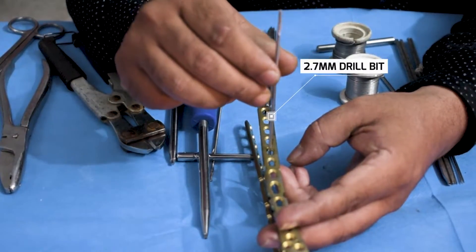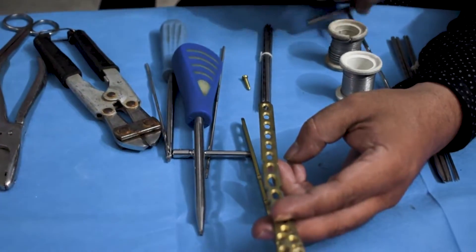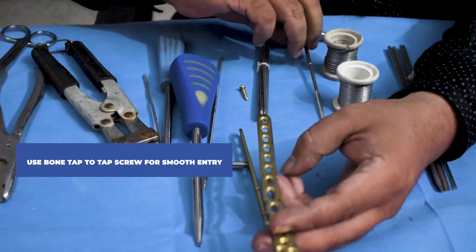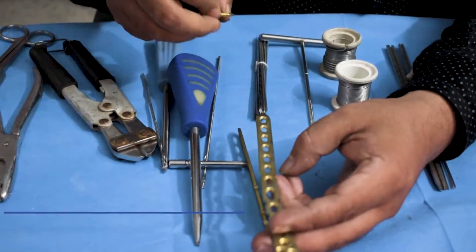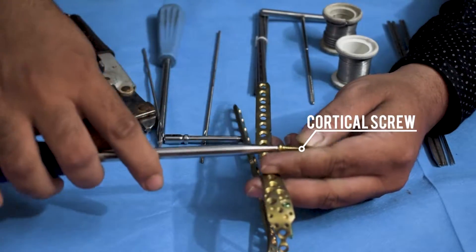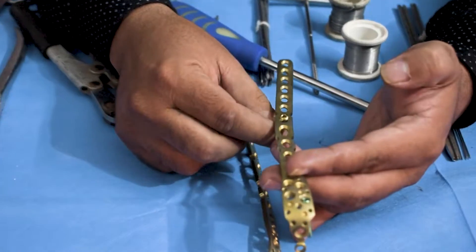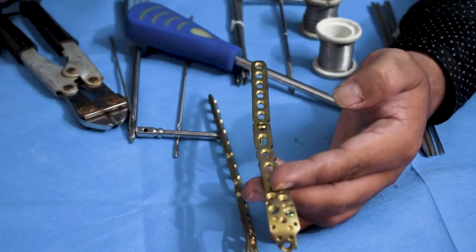To use a non-locking screw, first drilling needs to be done with a 2.7mm drill bit through the non-locking hole. After drilling, if required, you can use the bone tap to tap for the screw — tapping basically makes way for the screw. Then the cortical screw is attached in the hole. Always remember: the cortical screw gets fixed in the bone and not in the plate; it always dynamizes the bone.